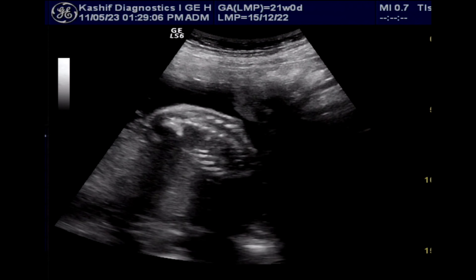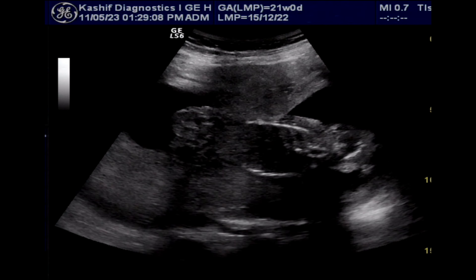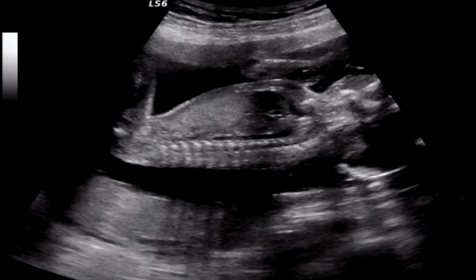This is an obstetrical scan according to LMP. This is 21 weeks gestational age.